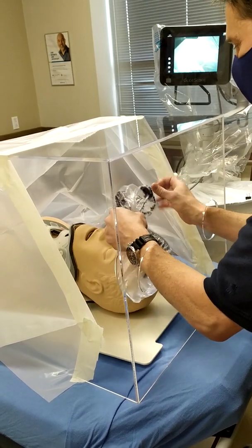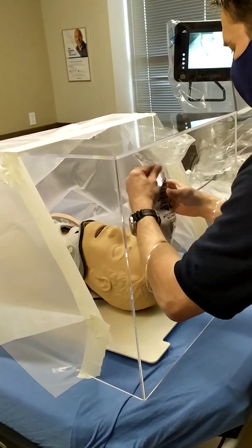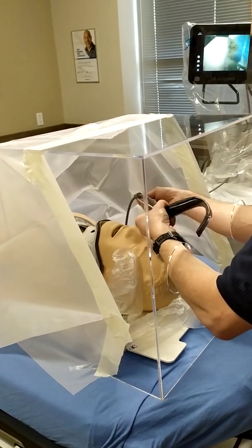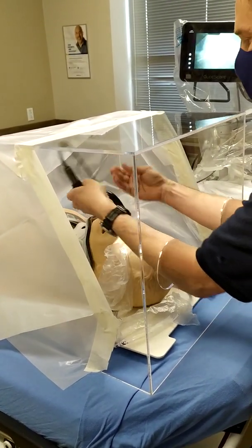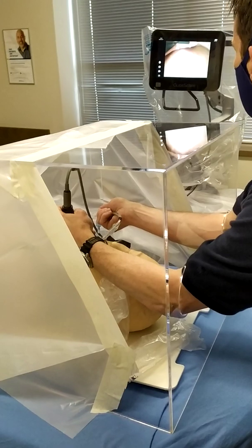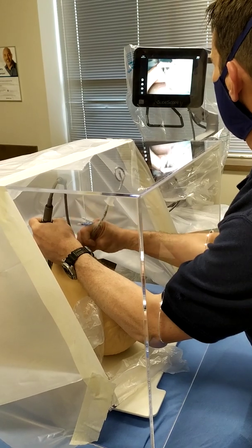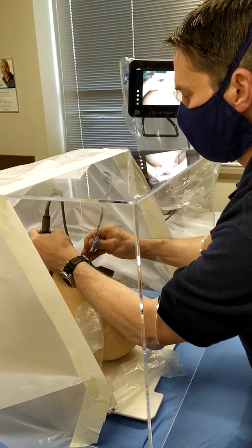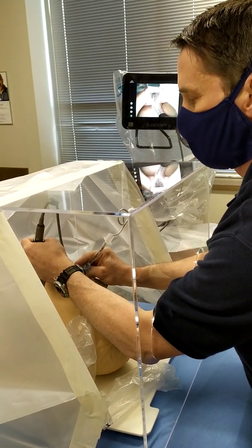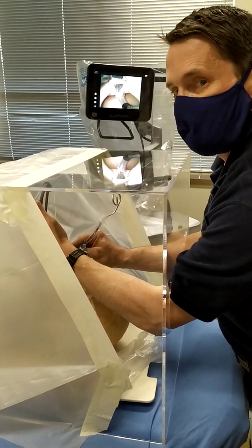As opposed to some folks who have been using bags laid over the patient as a technique — which is possible — in this case you're still able to work with the patient. You've got a good view, you've got the time you need to work with your patient, you've got good protection, and my face is completely up and covered above here. This is the advantage this box gives you.